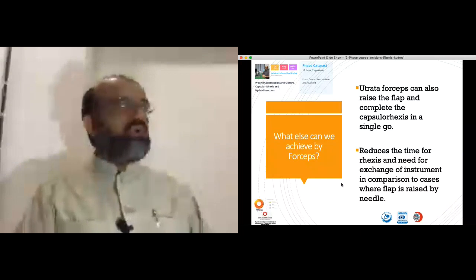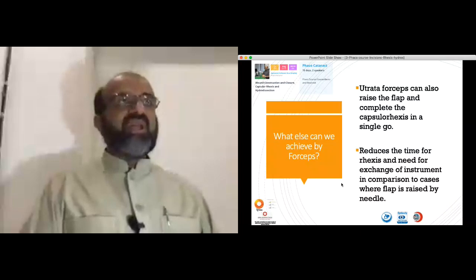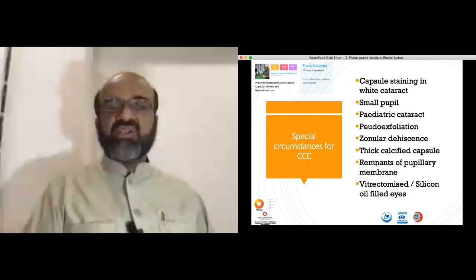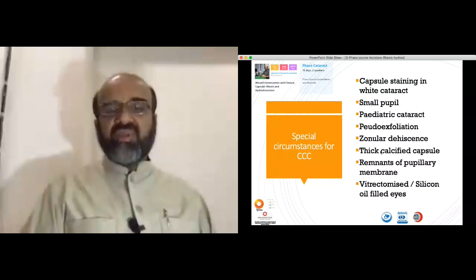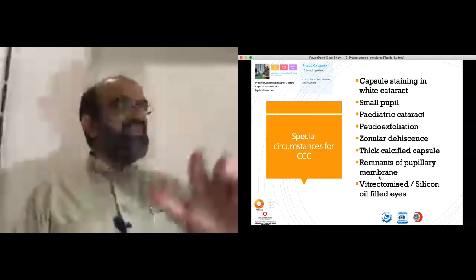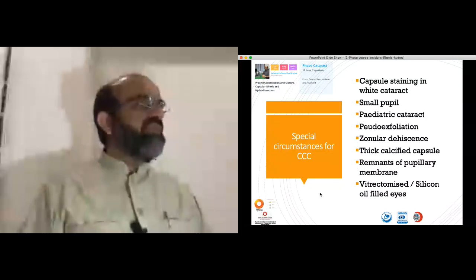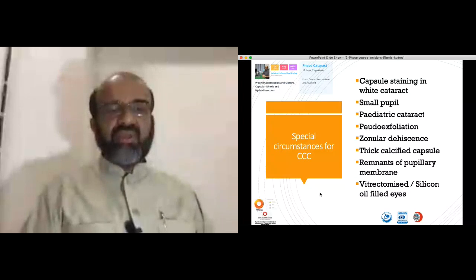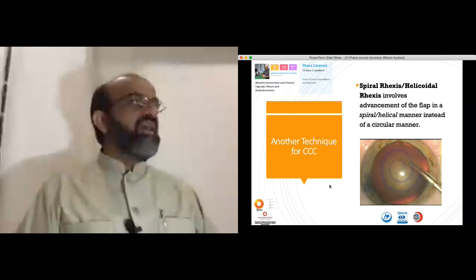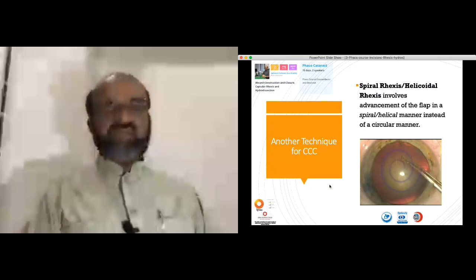If there is no good fundal glow, we can always stain the white cataracts. If the rhexis is going to be difficult in small pupils, in pediatric cataracts, in pseudo-exfoliation, in zonular dehiscence, in pupillary membranes, in vitrectomized and silicone eyes, all these things we will discuss in our section on difficult cataract cases. This spiral rhexis technique, we will also explain it, and there will be a video once we have a discussion on difficult cataract management.